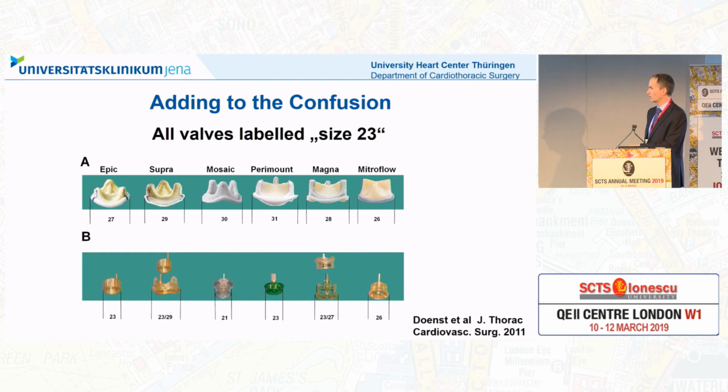And the other guy puts this one here and says, oh, I have to enlarge the root or enlarge the aorta or whatever. It's only because the tools that the companies give you in your hand vary in the dimensions. And if you change valve type, all of a sudden, you experience differences. Oh, this is difficult. Yeah, because there are different diameters. There are different sizes on the outside, and that's relevant to the surgeon.